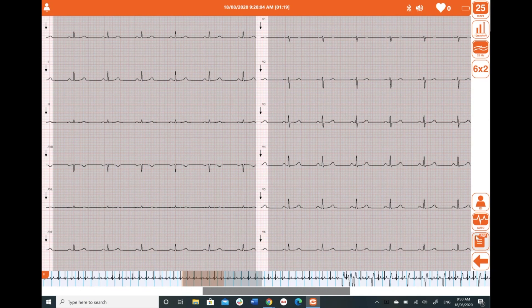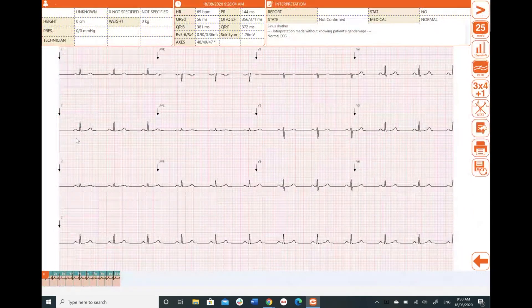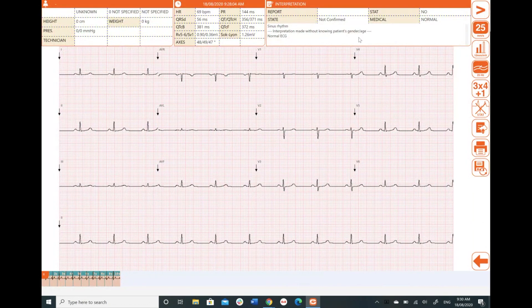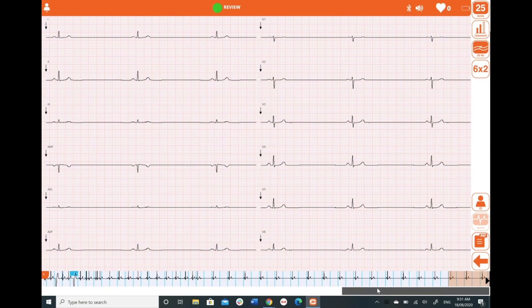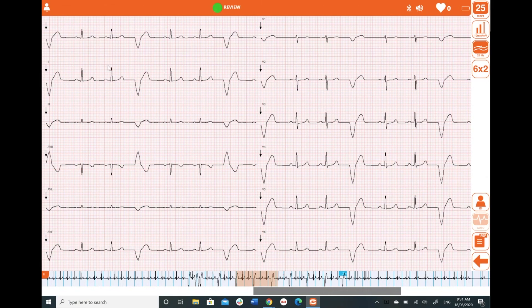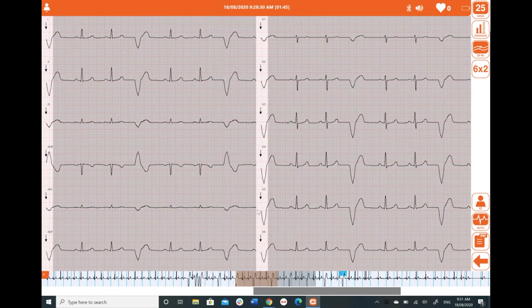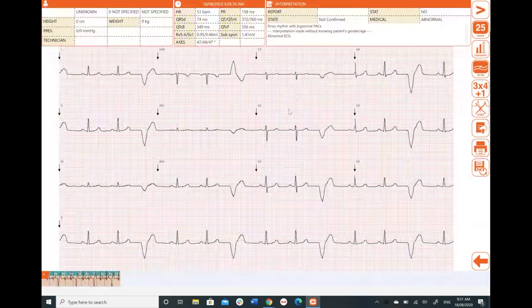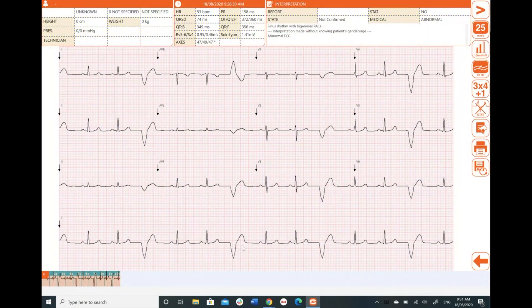Then I hit auto — that's one report for this patient. The Glasgow interpretation software, which comes as standard with this device, is going to interpret my strip. Then I go back, scroll along, right-click to position the strip, left-click to highlight — and if I hit auto now I have a second report for the same patient. You'll notice the rhythm strip down the bottom corresponds with the beats shown up top.